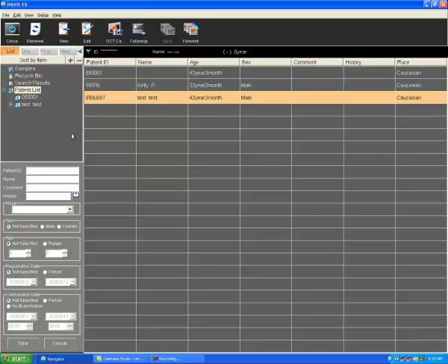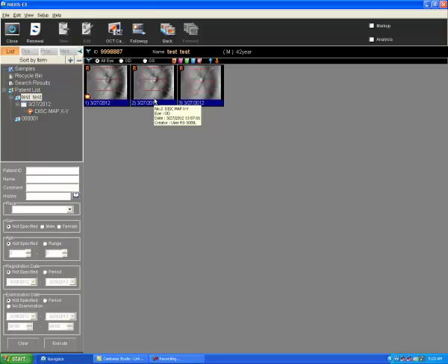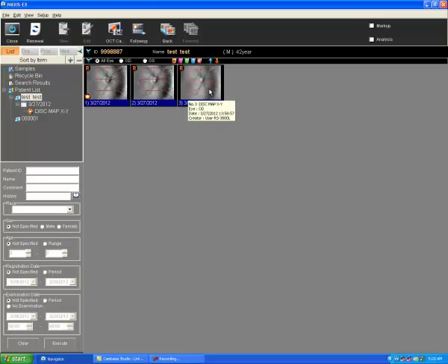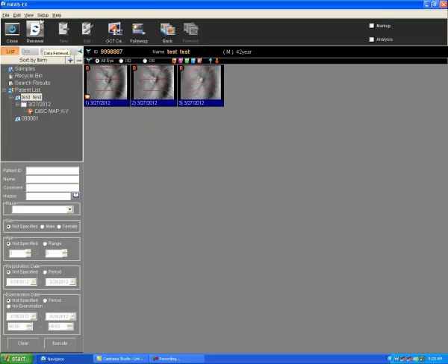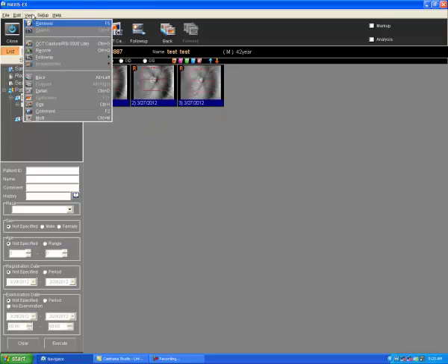In this example, it's this patient here, test test. I'll open them up and I'll see there are three tests here already. To get those deleted tests into this patient, I need to go into the recycle manager which is here under the view.